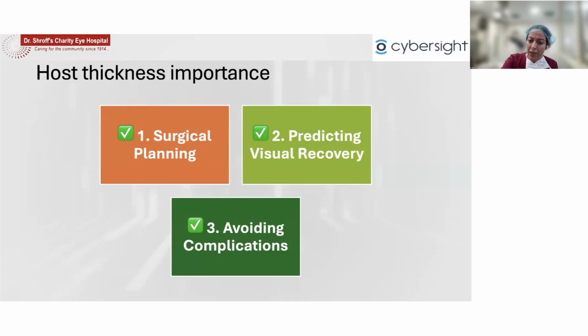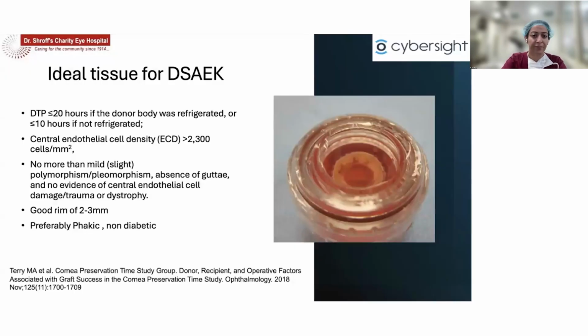The graft adherence may be a little more challenging. And also the complications that you can have with increased corneal edema, and poorer view has obviously to be emphasized as well. Usually more than 1,000 microns, we prefer to do a penetrating keratoplasty instead of a DSAEK.